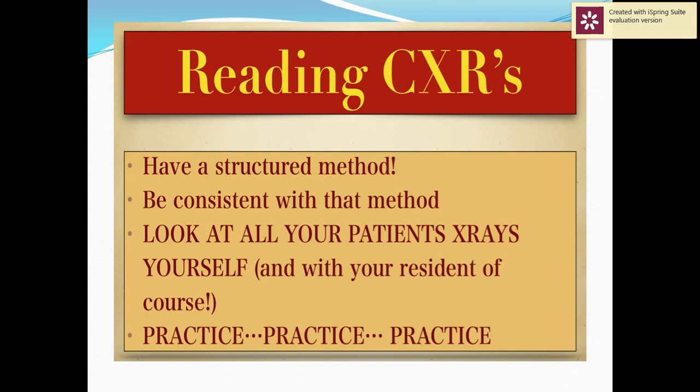Look at the patient's X-ray yourself. بعض الأحيان بيجي البيشنت بيقول لك والله عملوا لي أشعة في المستشفى وكانت قالوا لي كويسة ما فيها حاجة. Usually you should look to your patient chest X-ray yourself and to practice to read the proper way.